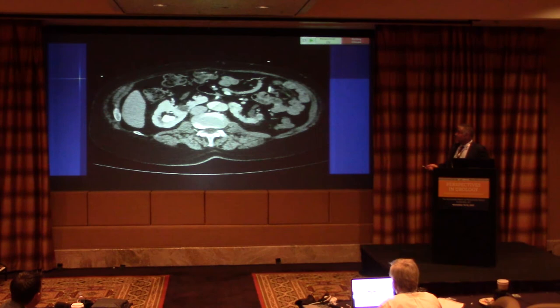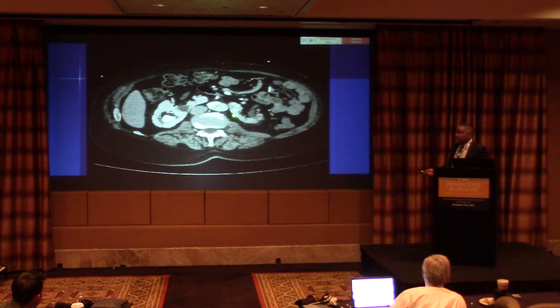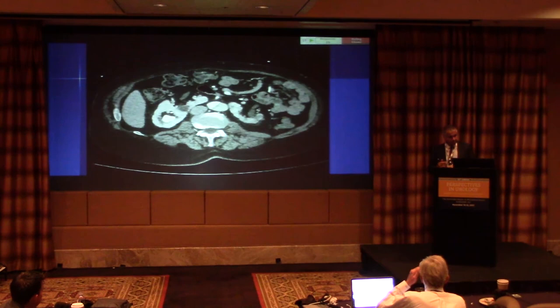Horseshoe, very good. So horseshoe kidney, this upper pole calyx here would be easy to access, but if one needed to access this one here, these axial images guide you that the bowel is in the way. So this would be a patient, if you went higher and there was still bowel in the way and you needed access to the left moiety, it would be best to do under ultrasound guidance as opposed to endoscopic guidance.